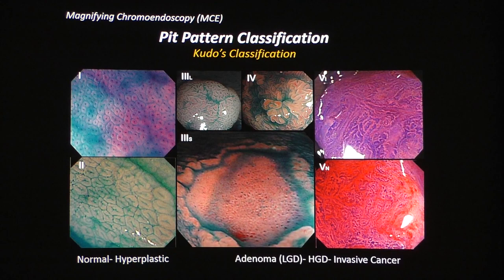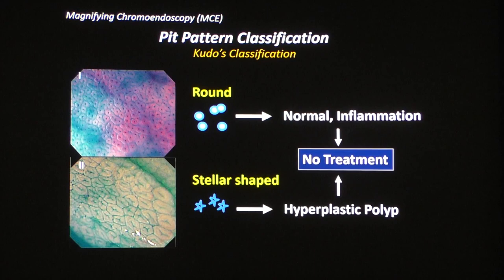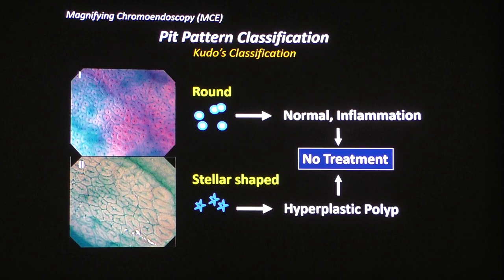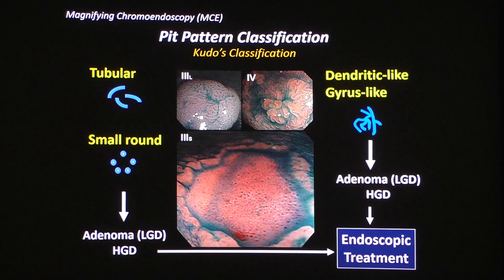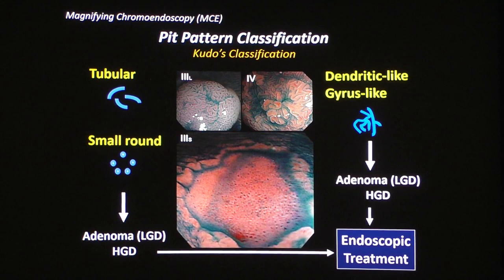Next, let me talk about magnifying chromoendoscopy diagnosis, the so-called pit pattern classification. Many of you already know there are several pit patterns from type 1 to type 5. Type 1 pit is observed in normal mucosa — a round pit called type 1 pit. Type 2 pit is a stellar-shaped pit, often observed in hyperplastic polyps. Type 3L pit is most often observed in daily practice, indicating adenoma, where a tubular pit is seen.